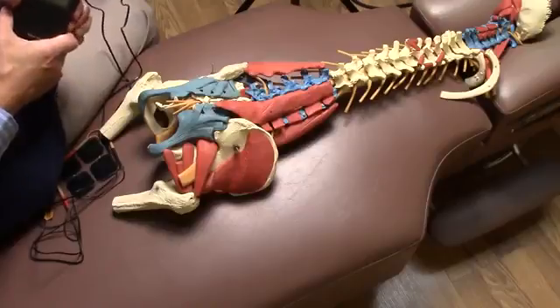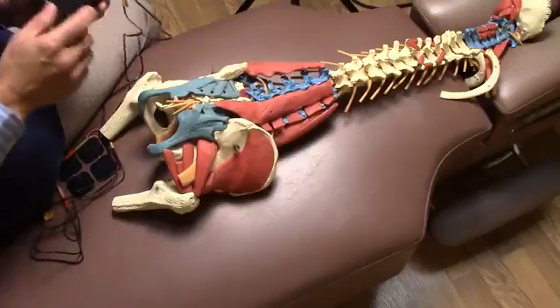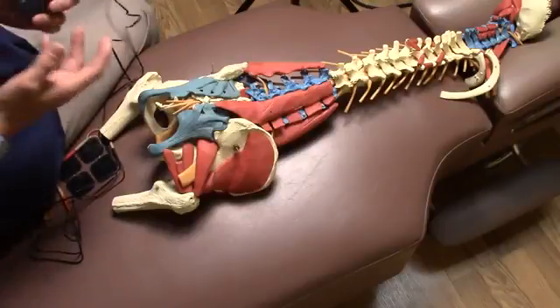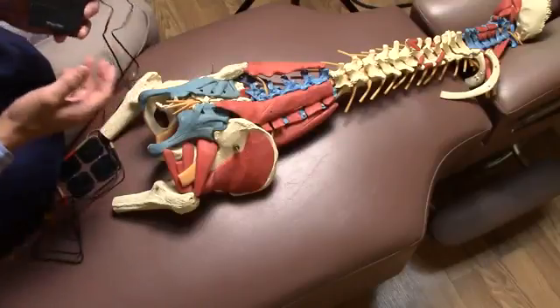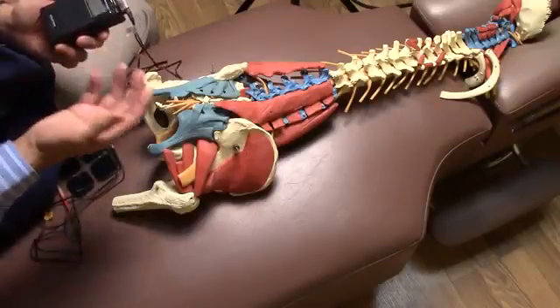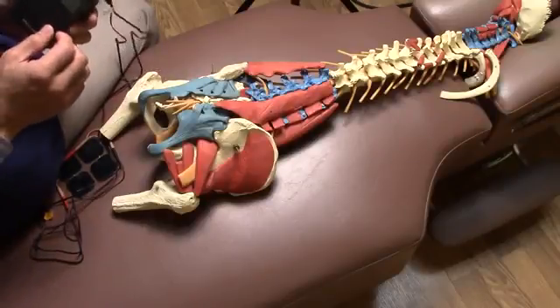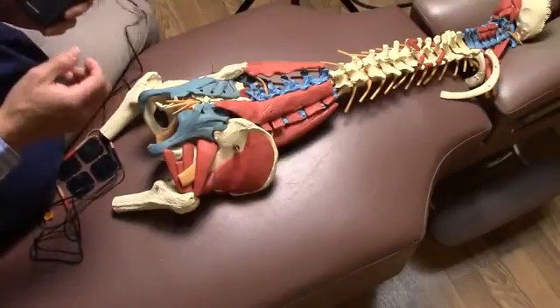Now, with this TENS unit, it's actually not an exact science. You're going to have to experiment with the placement and the pulse width and pulse frequency settings to see which combination gives you the best results. That's the beauty of the device, is that you could do this testing and get the treatment at the same time without any adverse outcome. Feel free to experiment with the settings, because there's no way really to mess it up by having the wrong setting. There really is no wrong setting.